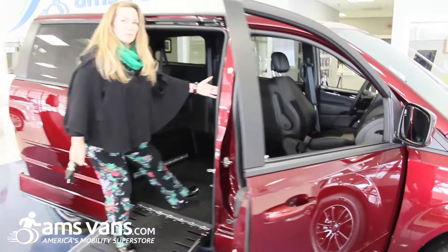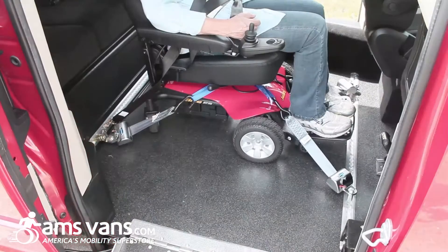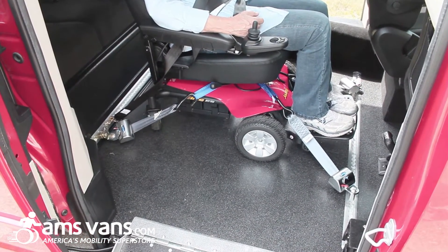The front passenger seat is removable, allowing for the person to sit in front with their wheelchair. We secure them to the floor of the van. You can also secure them to the inside mid-row in the van.